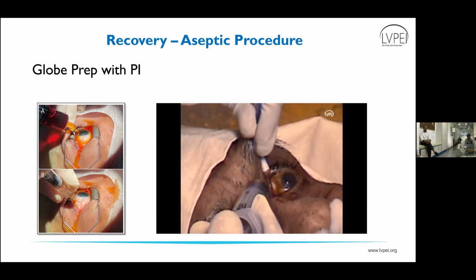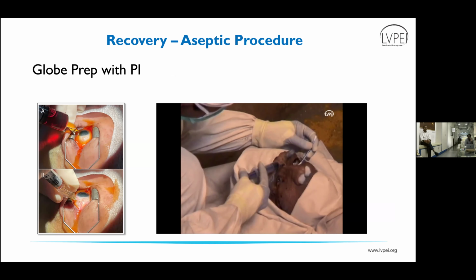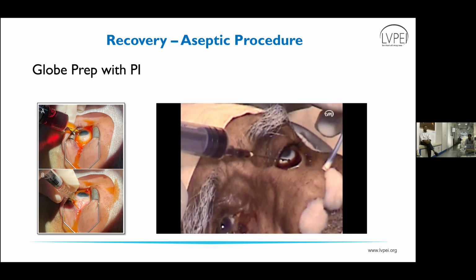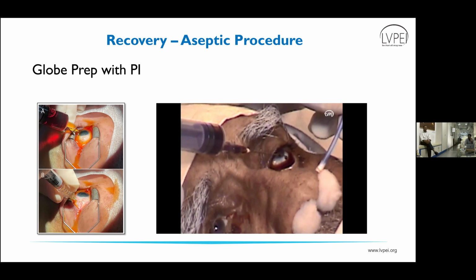About 3 ml we have to drop onto the eye. First, drop about 1 ml in the lower conjunctival sac, and then roll back the upper lid, and drop another 1 ml in the upper conjunctival sac. The remaining 1 ml we have to drop on the cornea.